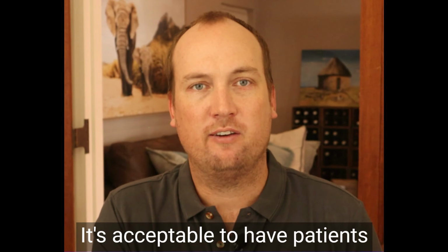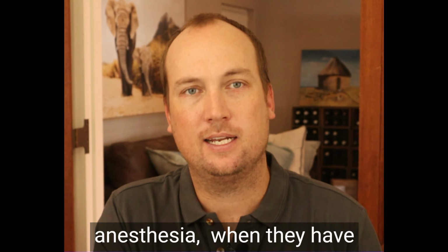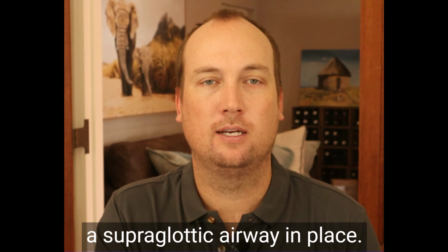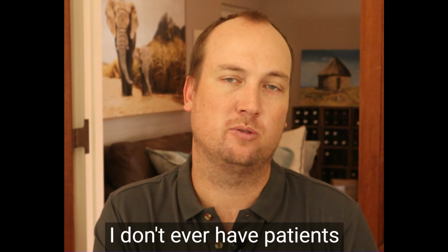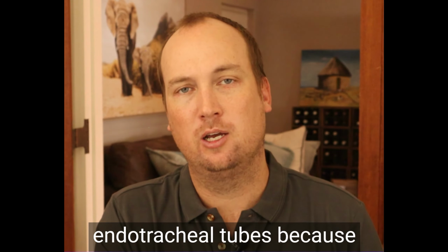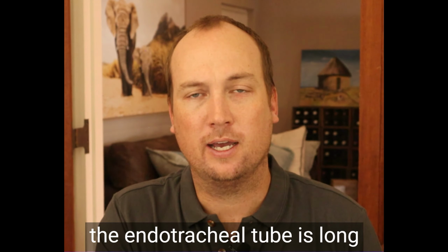It's acceptable to have patients breathing spontaneously under anesthesia when they have a supraglottic airway in place. I don't ever have patients breathing spontaneously intraoperatively through endotracheal tubes because the endotracheal tube is long and thin.